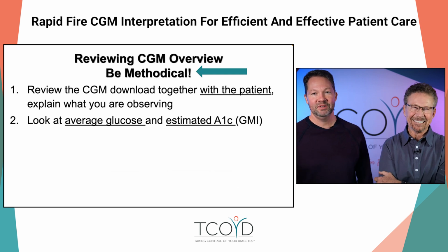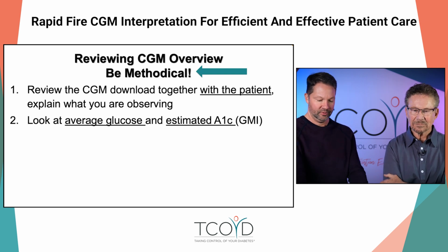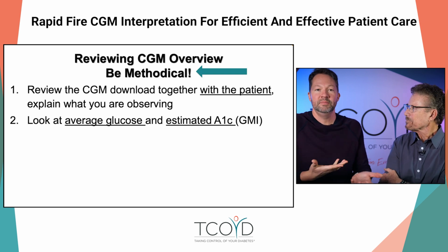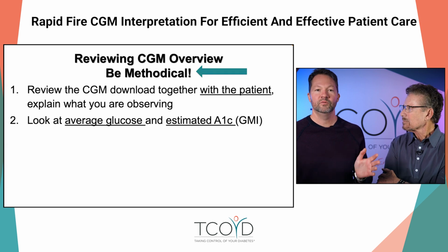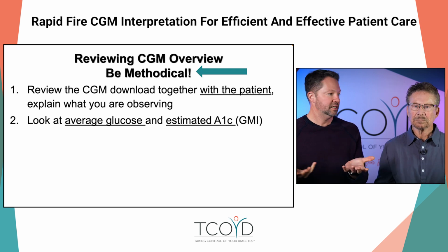So review the CGM download together. This is important because there are so many times that doctors come in and say, I reviewed your chart results and this is what I think. Turn the screen around, show them what you're looking at, because the data you're looking at is the same stuff that they see on their phones, on their apps, regardless of what system they're on. They're looking at this time in range metric. They're looking at their average blood sugars. So, for God's sakes, go over it with them.